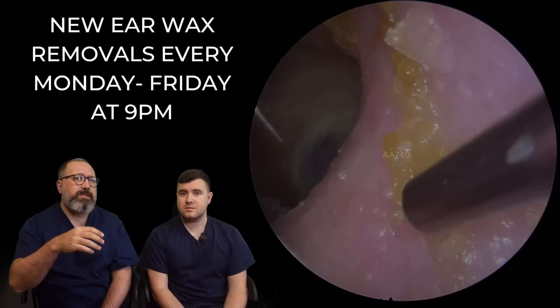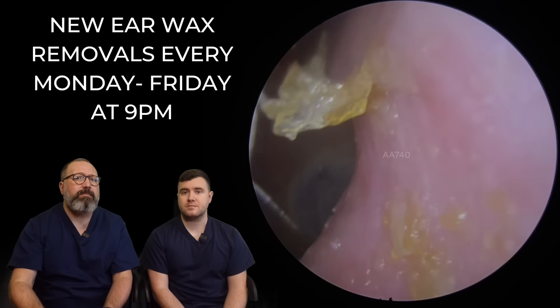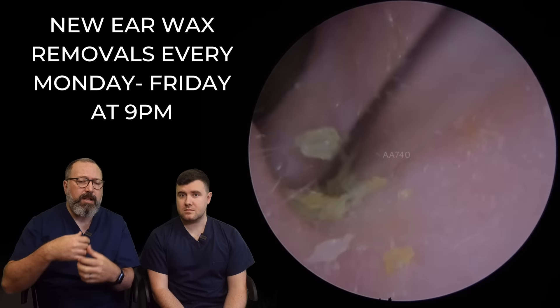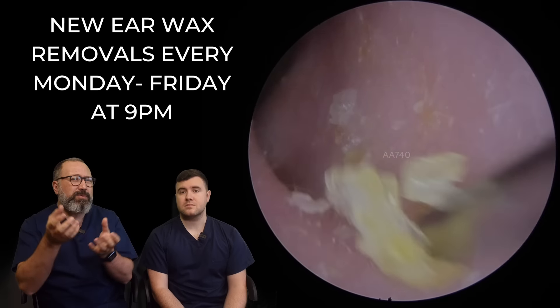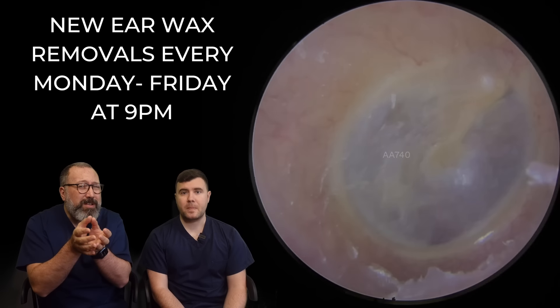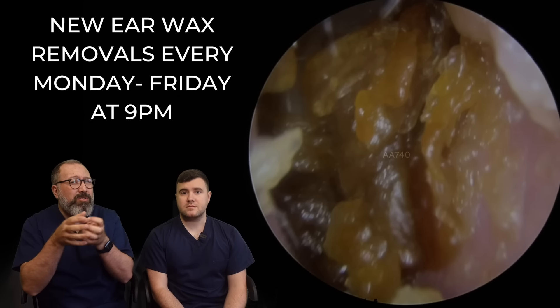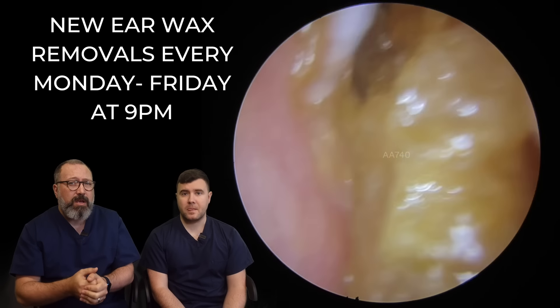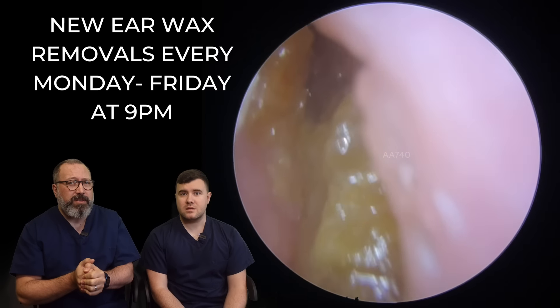Now, we talk about the skin migrations — epithelial migration from the ear canal, from the medial to lateral portion of the ear canal, about three millimetres a month. You could see just how much came out there in a short space of three months. That is a lot. So this is almost like an overproduction of skin in the ear canal in this one, and a little bit wetter on this side as well.